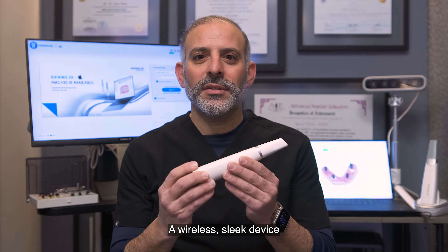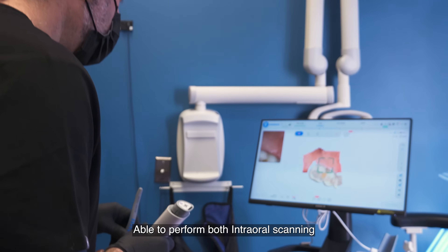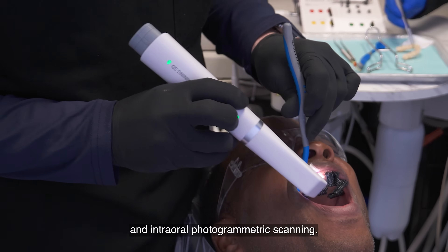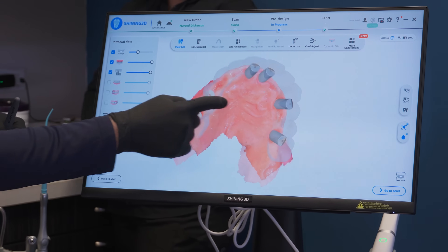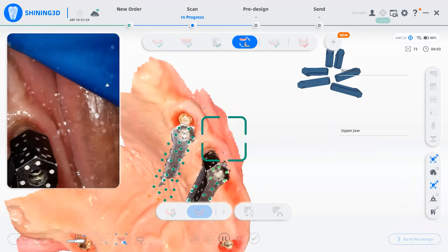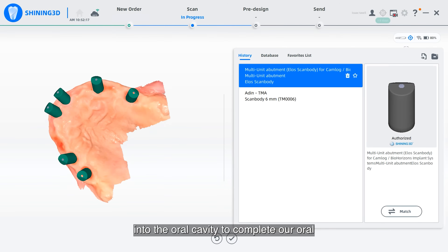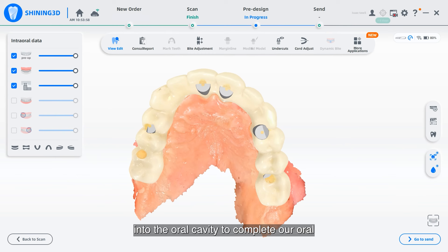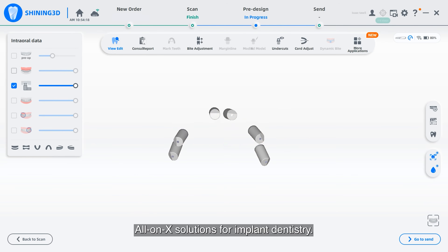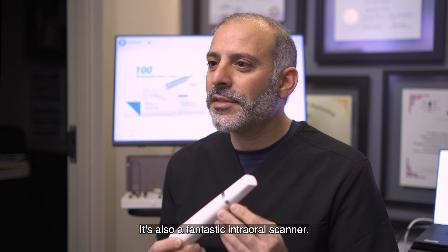Our new designed product will wirelessly scan the mouth with intraoral scanning and with the added benefit of having the accuracy of intraoral photogrammetry. A wireless sleek device, only 194 grams, able to perform both intraoral scanning and intraoral photogrammetric scanning. But this is not just a photogrammetric solution — it's also a fantastic intraoral scanner.